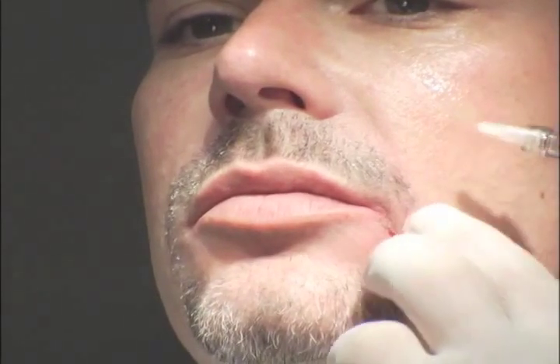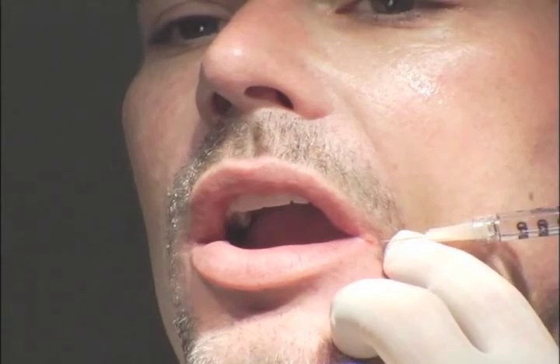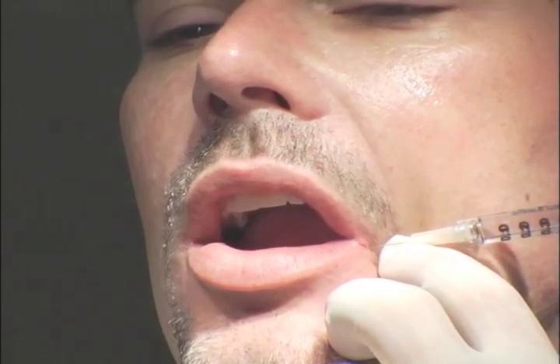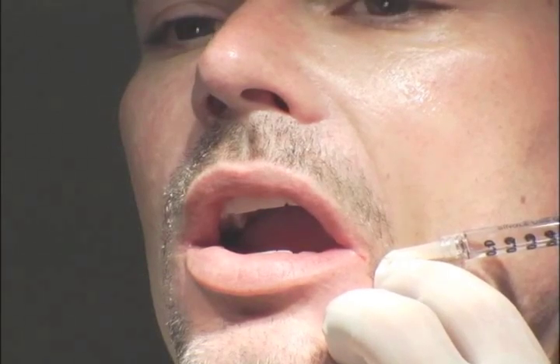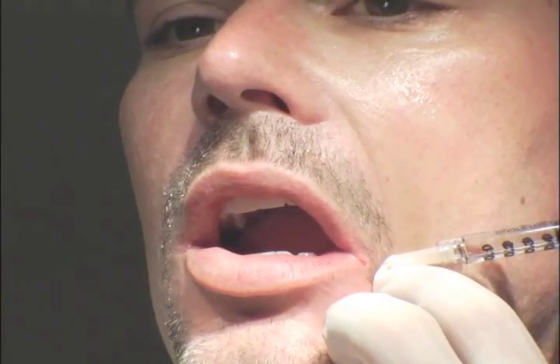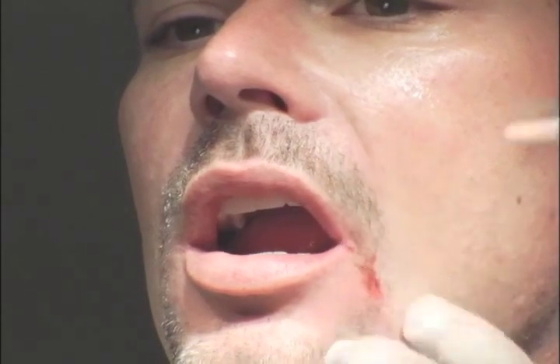Now we see this denting right down here. So what we want to do is bring his lip out a little more yet. Open your mouth. We want to bring his lip out a little more laterally. So we just put a little shot, a little laterally going into the lip, just like that. And that will bring the lip out more laterally than we even were before. There we go. And how much does that hurt? Okay. So you have to go slowly, and you have firm pressure against what you inject.